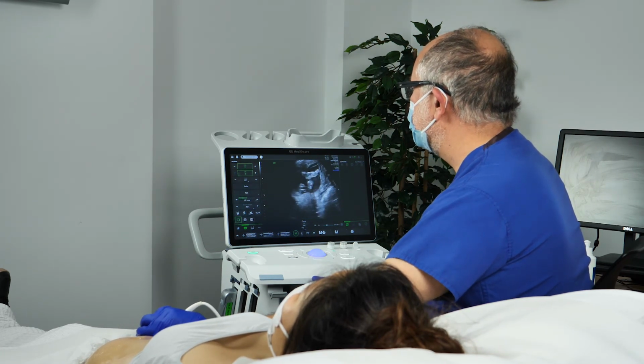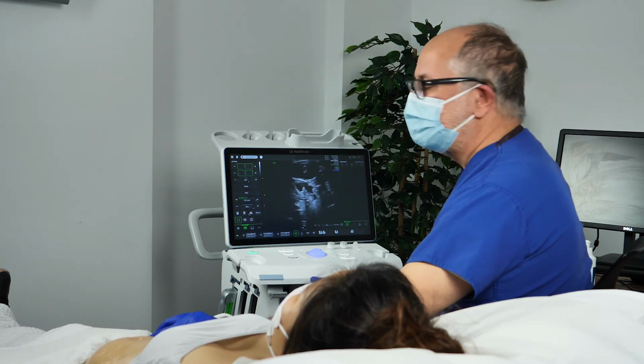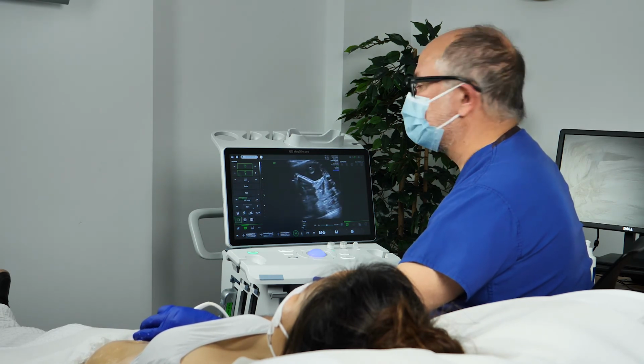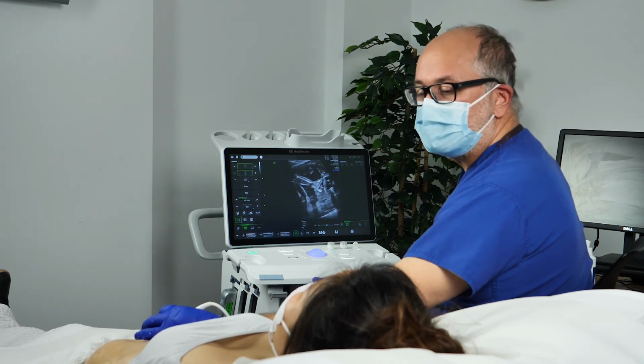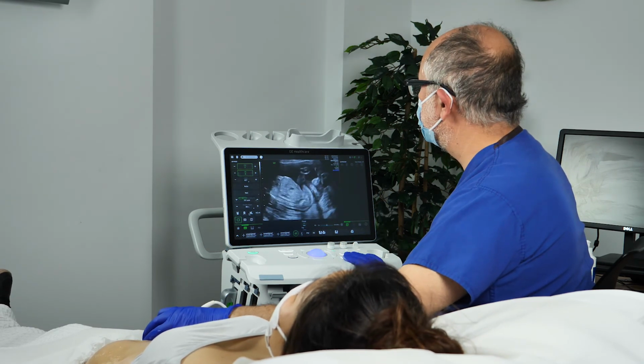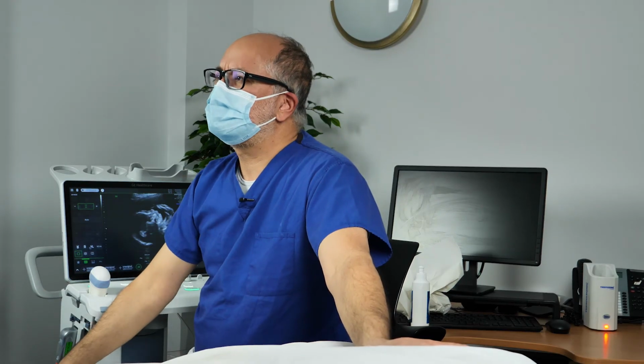In some countries, they have ultrasound in the hands of people who don't regularly do ultrasound. So maybe your general obstetrician or your general gynecologist who does very few cases, and may find something like this really, really helpful. So the standard of care is very variable around the world.